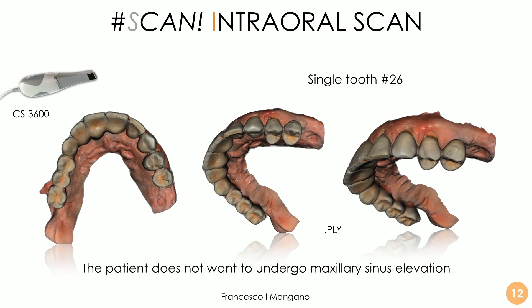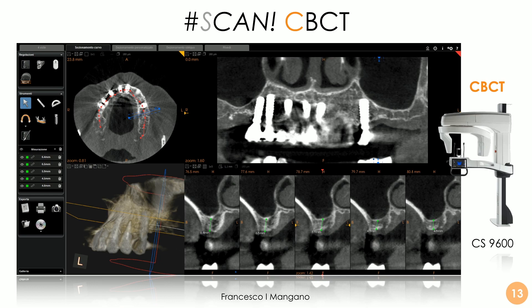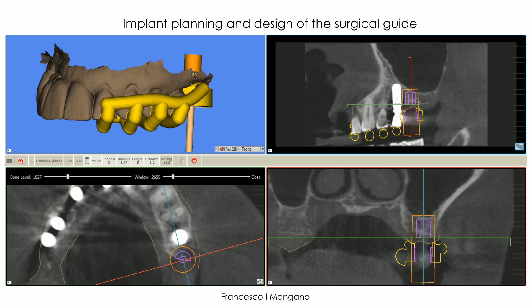Here is another case, scanned with the CS3600. The patient wanted to add one tooth in the upper maxilla on the left — the first molar — but she didn't want to undergo any maxillary sinus elevation. There was the prosthetic space for the tooth, but unfortunately very little bone was available. However, we had the possibility to insert a short implant, and we did it accordingly. The design of the surgical guide was performed inside SMOP using the valuable tools for surgical guide design — once again, implant planning and guide design inside SMOP using the full module.